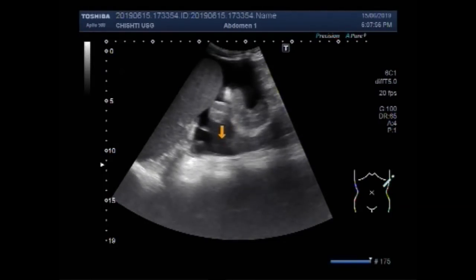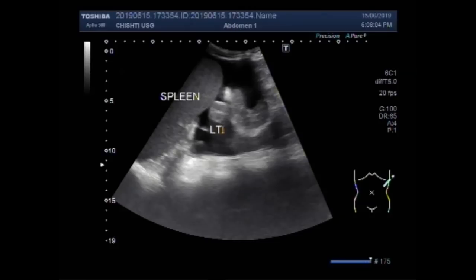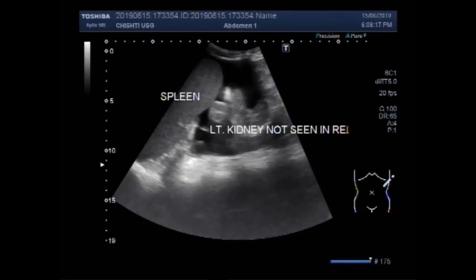The left kidney is not visible here. The left kidney is not seen in this area, in the renal angle. So it may be ectopically placed, or missing.